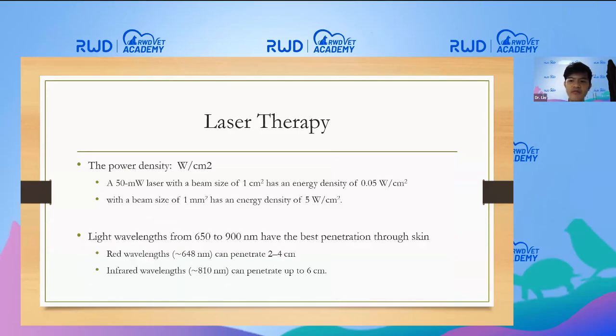The power density of the laser is defined as the laser energy supplied per area. We usually call it watts per square centimeter. It influences its depth of energy penetration.